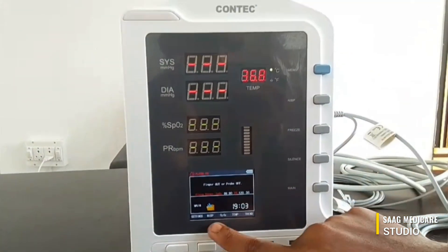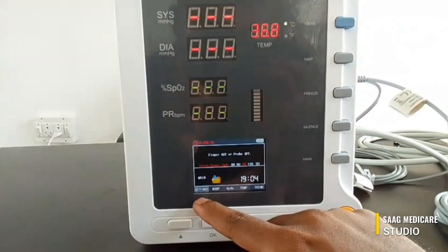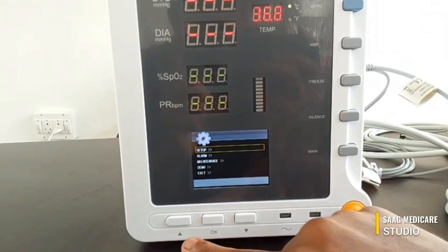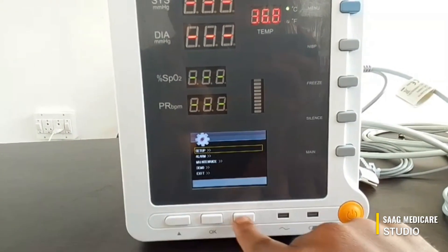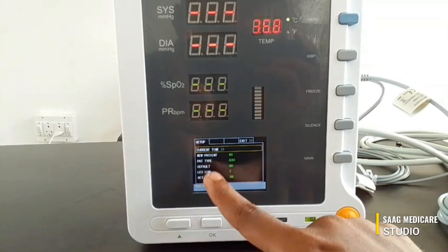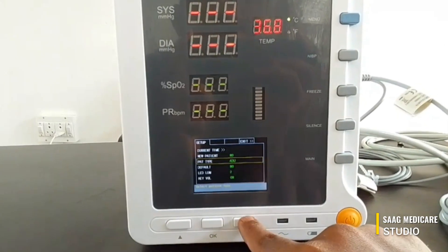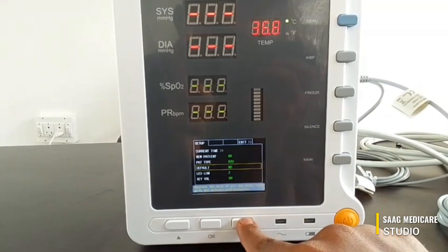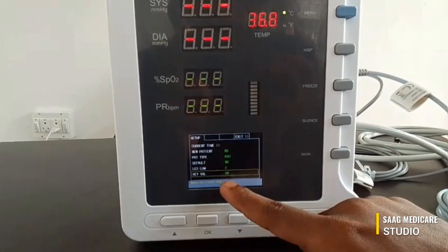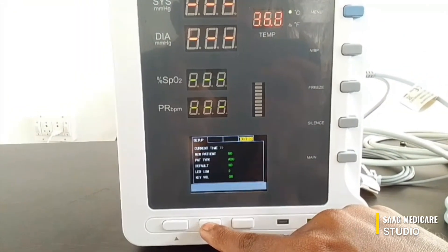You can access the settings by pressing the menu button. After pressing it you can see there is a box appeared around the menu settings button. You can click OK to enter. To move up and down you can use these two buttons as arrow controls. In setup you can adjust time, new patient, patient type, change to default, and LED brightness, and turn the key volume on and off. To exit just click the OK button.